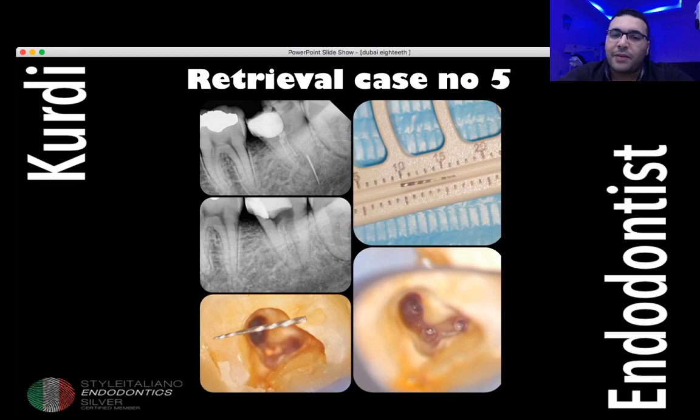But in such cases, ultrasonic only will not be right to be used, because you are afraid of harming the tissues beyond the file, or even pushing the file deeper. So in this case, I made the staging platform with Gates-Glidden and ultrasonic troughing without touching the file around it, and then with the lowest power on Ultra X, and then with the wire I removed the file.